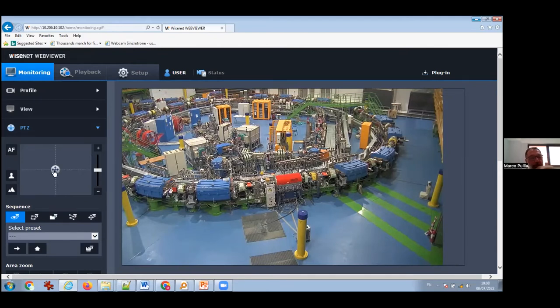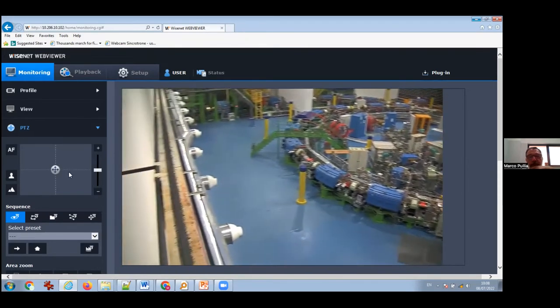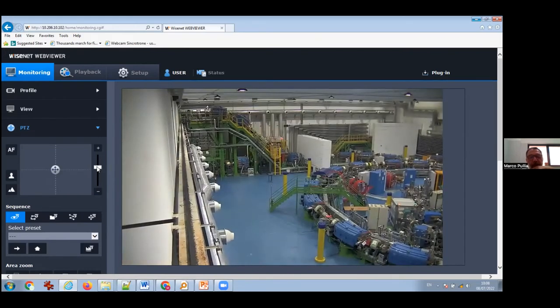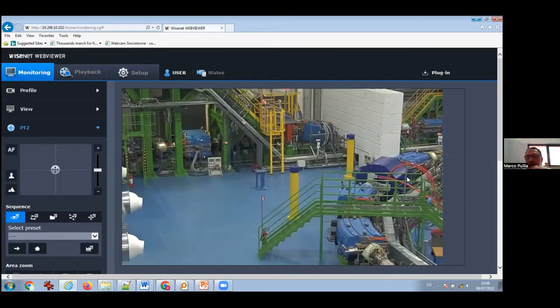On the left, we have this big blue guy, which is our Betatron core, which is used to push the beam into the resonance.